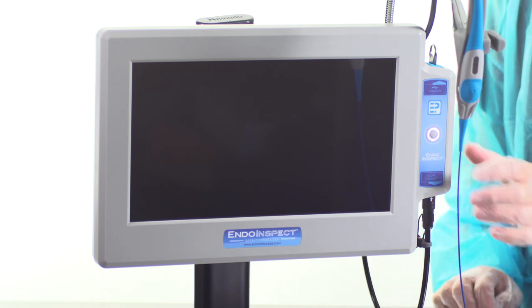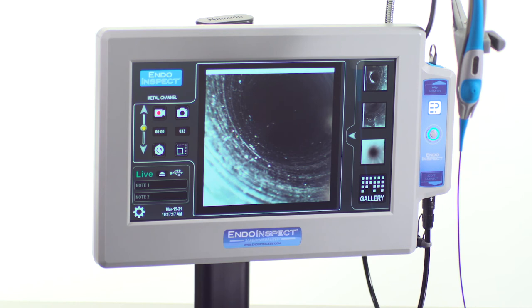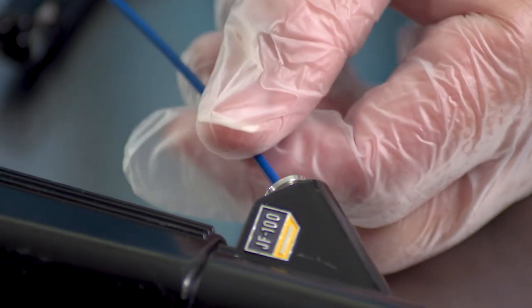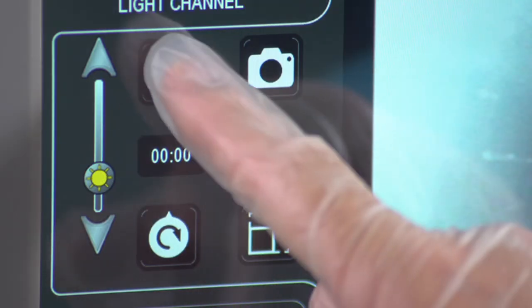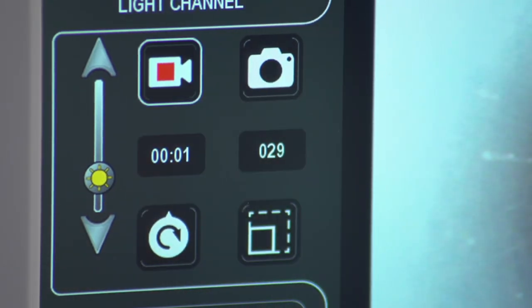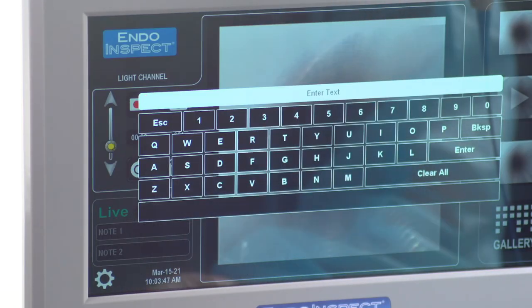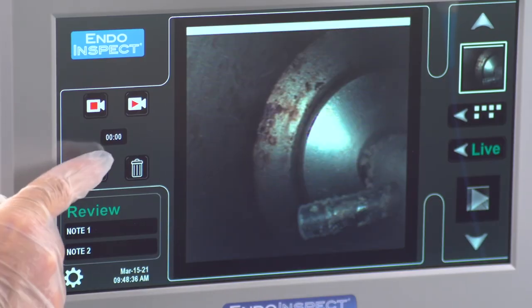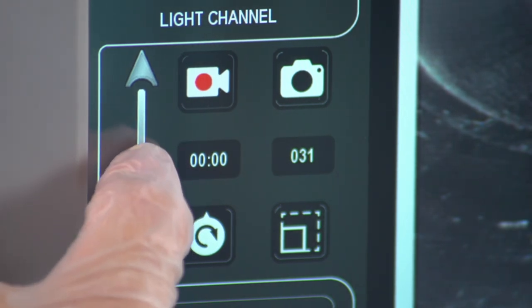Best of all, the IndoInspect is super easy to use. Just turn the system on and you're ready to go — no setup is required. The diameter of the current probe is on the handle. Insert the working length of the probe into the lumen or channel that requires inspection. To record video, press the record button. To capture a still image, press the photo button. To add notes to images and video, use the touchscreen keyboard. You can adjust the orientation of the image for optimal viewing, and use the touchscreen slider to adjust image brightness.